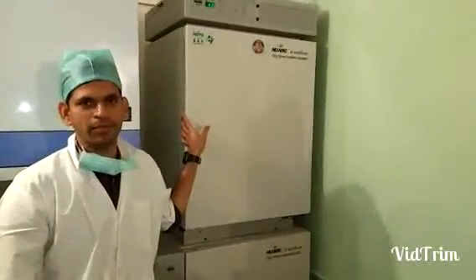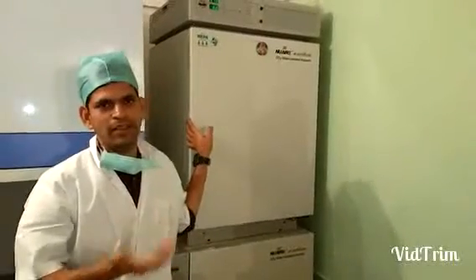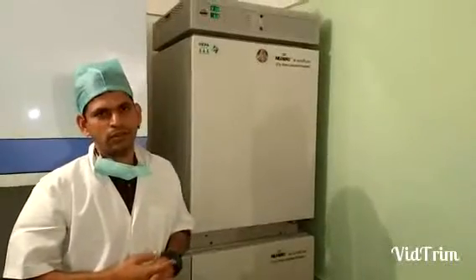CO2 Incubator is a very important equipment in an IVF lab. It is actually the heart of an IVF lab, as it plays a huge role in achieving good quality embryos, which actually decides the fate of an IVF cycle.